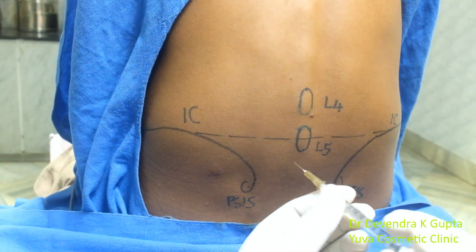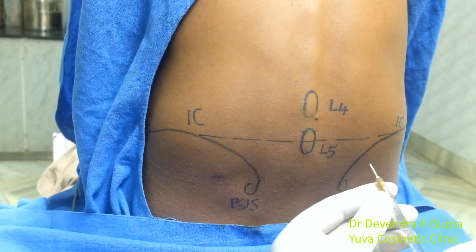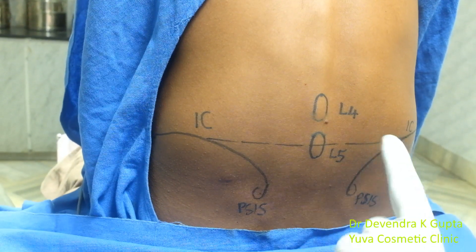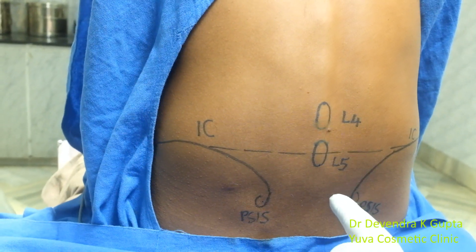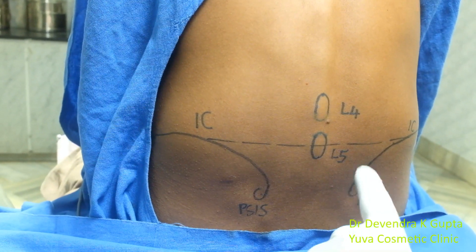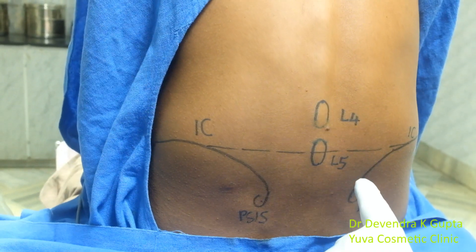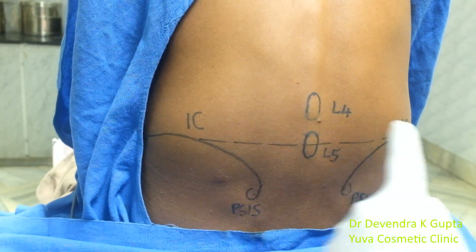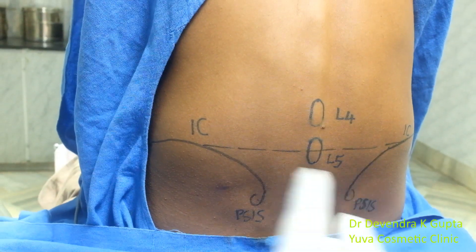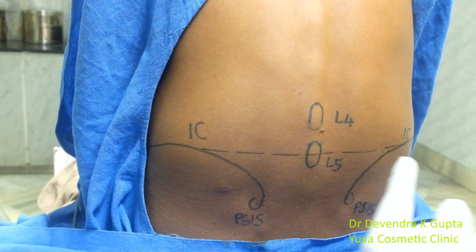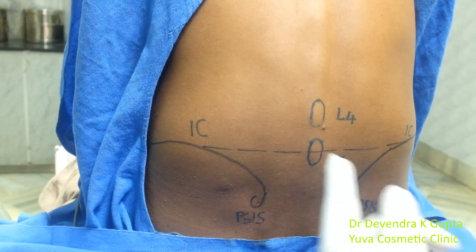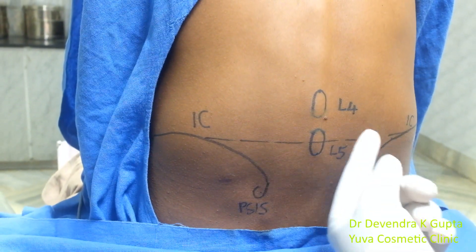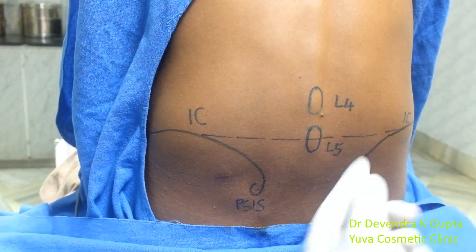I have taken a 26-gauge needle and initially anesthetize the space between L4 and L5. I have already marked the top of the iliac crest here. Using Tuffier's line, I have drawn a line between the two iliac crests that passes through L5, and I have selected the space between L4 and L5.